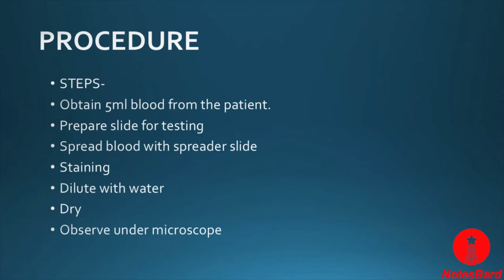So now let's discuss the procedure of the blood smear test. The blood smear test is a very important test and plays a crucial role in the speedy diagnosis of certain infections or diseases caused in patients due to abnormalities in blood cells. There are several steps followed by the technician or the physician in performing the blood smear test. These steps start by obtaining 5 ml of blood from the patient.